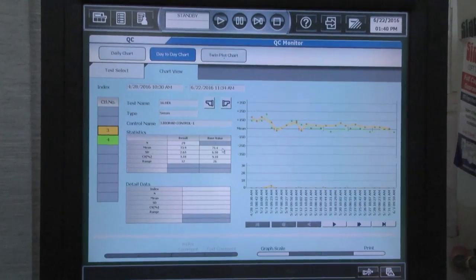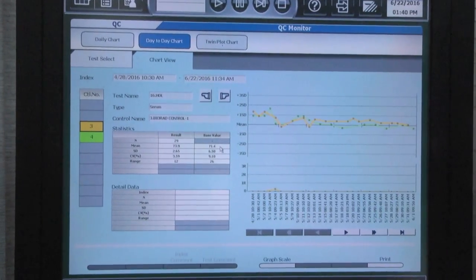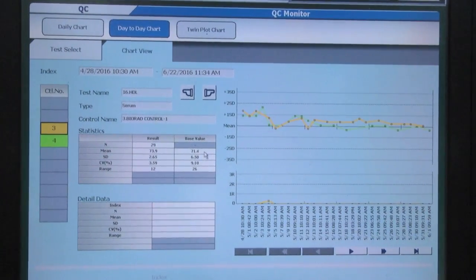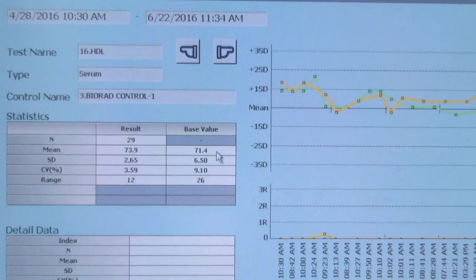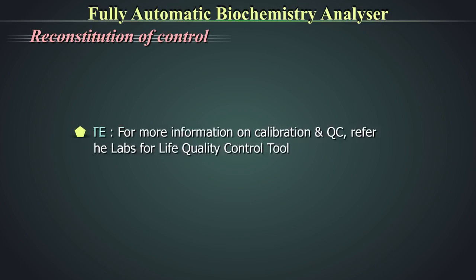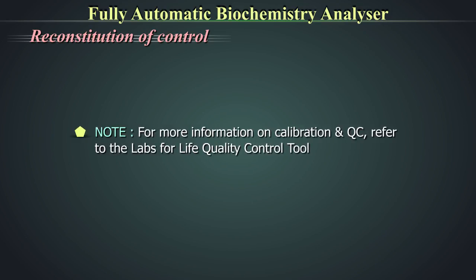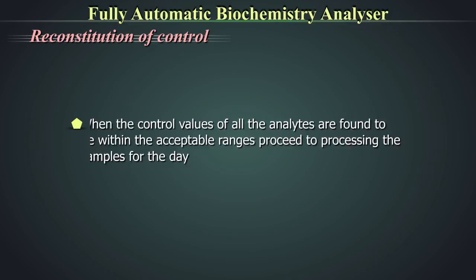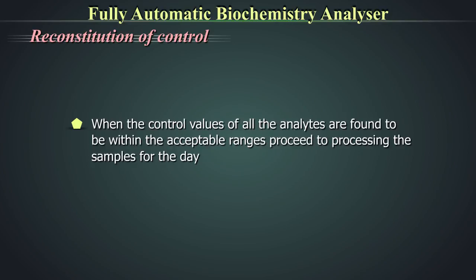In automated equipment, all quality control values are stored as data points and plotted on the Levy Jennings chart. The data points need to be evaluated within the defined standard deviation to be a valid run. If values are outside the acceptable range, corrective action needs to be taken. For more information on calibration and quality control, refer to the Labs for Life quality control tool. When the control values of all analytes are found to be within acceptable ranges, proceed to processing samples for the day.